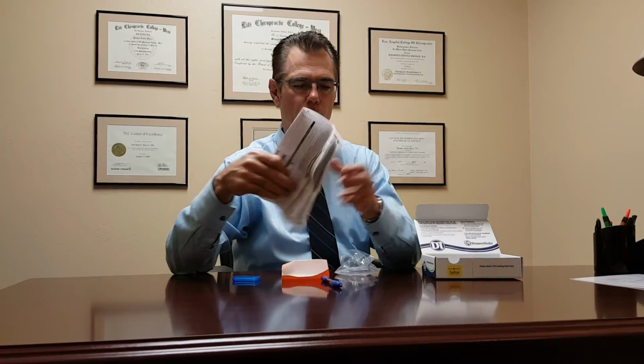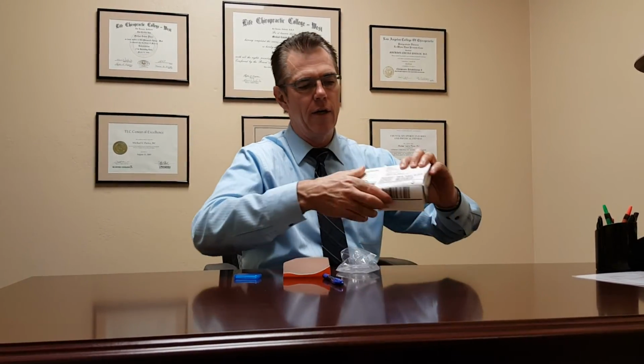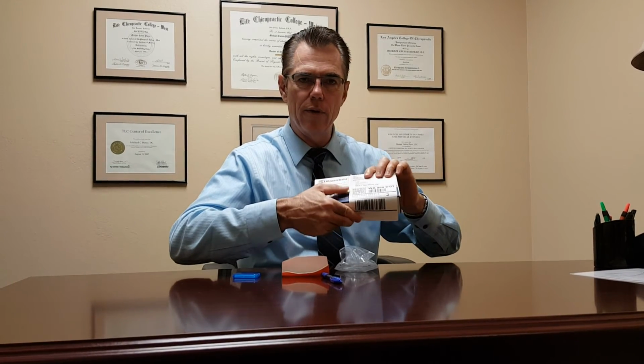Then you will be sure that you have the paperwork completed. You will fold up the paperwork, put it inside the box the next morning. You will close the box. You will apply the sticker on here which seals the box, and then you drop it off at a UPS, United Parcel Service collection center, and they will send that out.